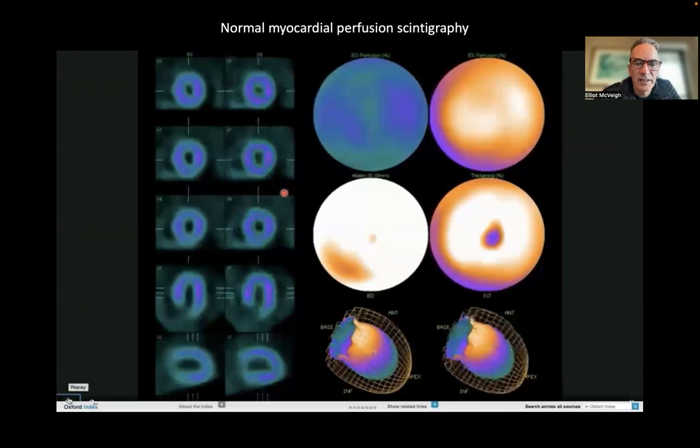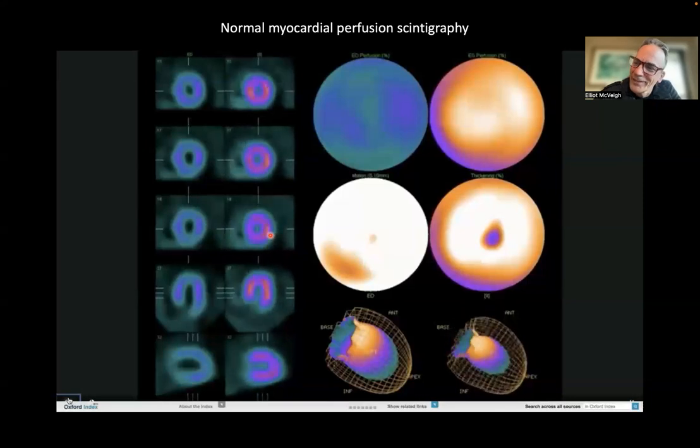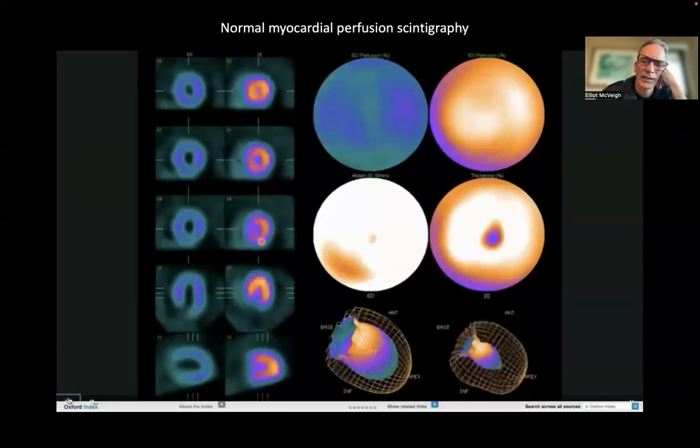You're basically collecting this data. The other thing is that if your resolution is able to resolve these different configurations, you should probably pick one as opposed to average them all together, right? Or you could at least have a range of positions available, or put a motion model in and do that as well before you made your bullseye.